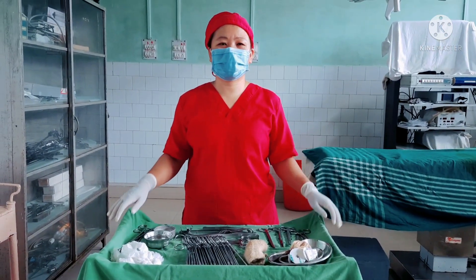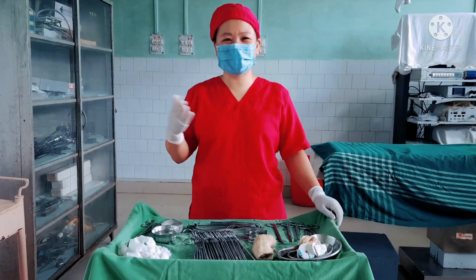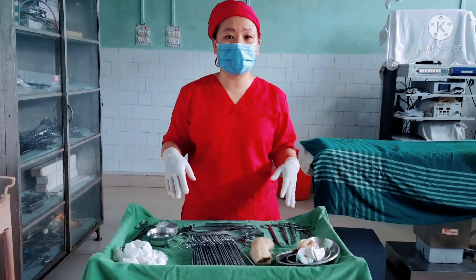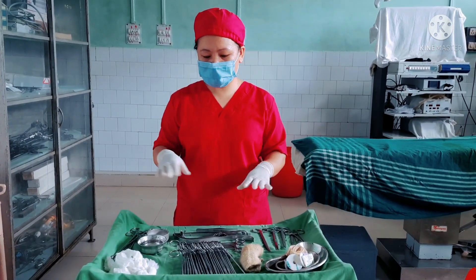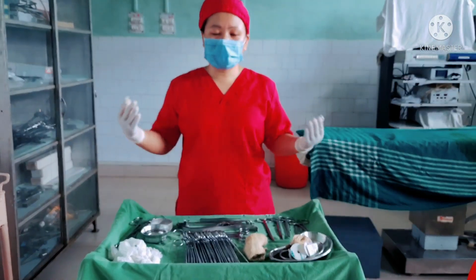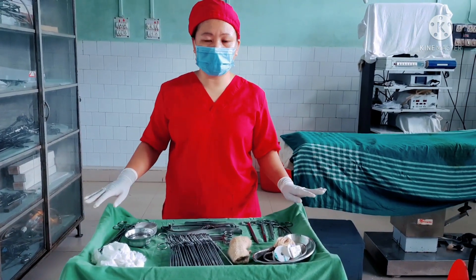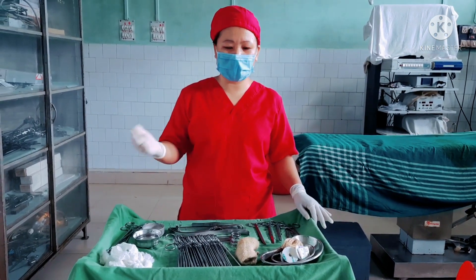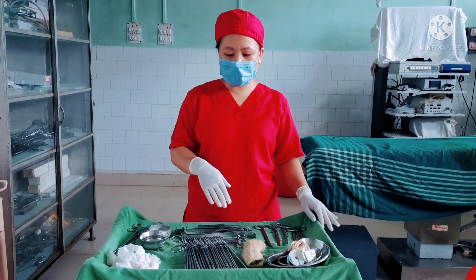Hello everyone, welcome back to Lucy's diary. I am Lucy and Rony, so my name is Lucy plus Rony. I will be showing the open appendectomy operation trolley along with the instrument purposes, so kindly watch and if you have any suggestions please suggest. As you know, every hospital has its own setup of operation instruments according to the type of operations. Here is where I am working in the hospital, and here is what we are setting for the appendectomy operation.